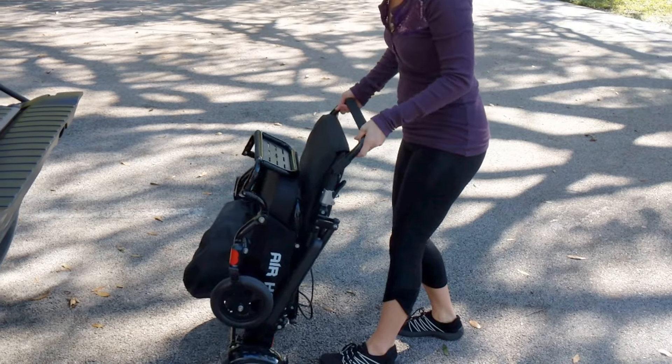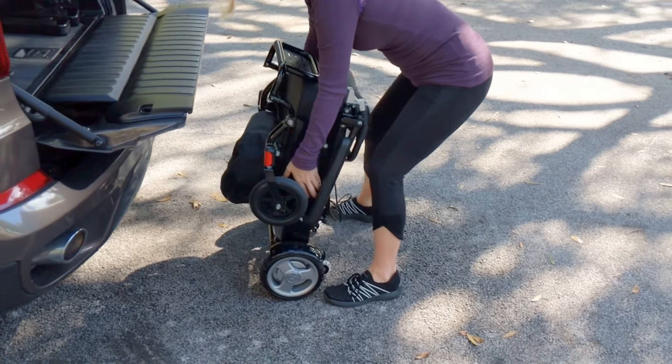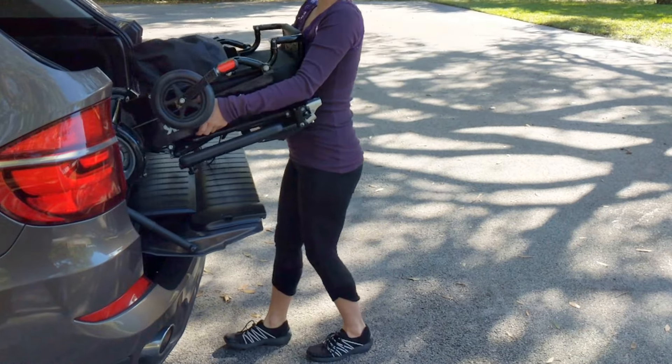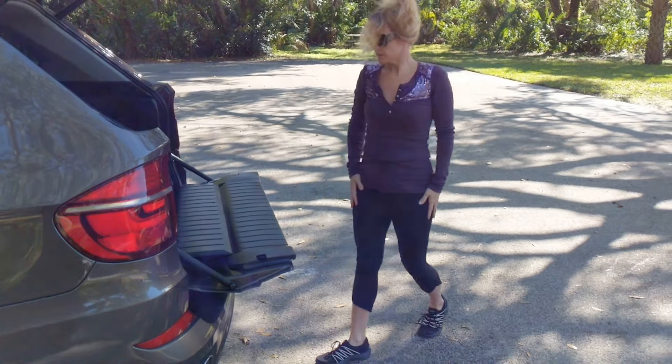Notice how she can actually pull that chair with the handle, so she can manage it in an airport and pull it behind her just like luggage. Folds down, makes it ultra compact. Look how easy it is to pick up and goes almost effortlessly into the back of a high sport utility vehicle.